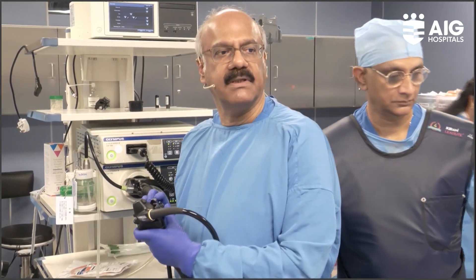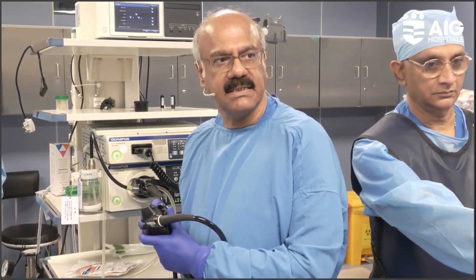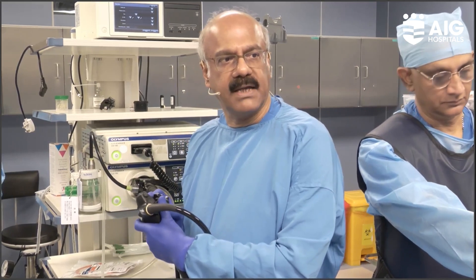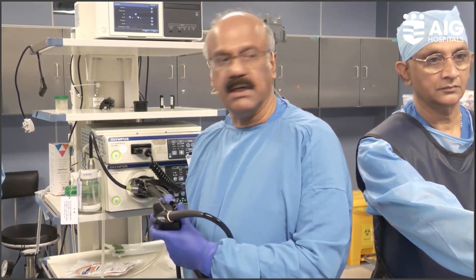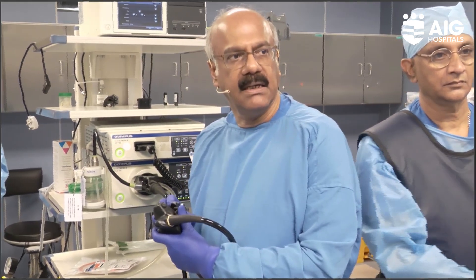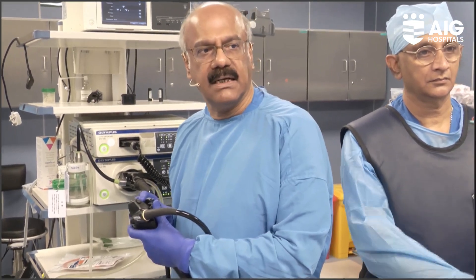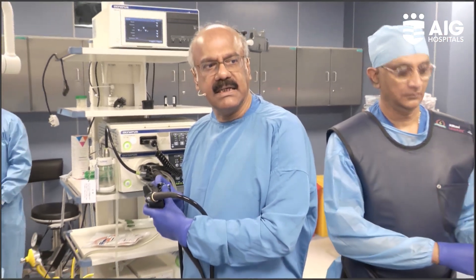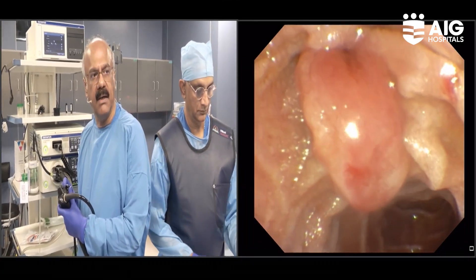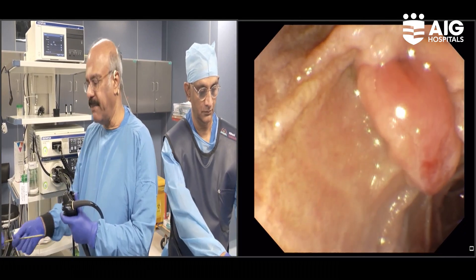This is a patient who has come with recurrent attacks of pancreatitis, and a previous endoscopic examination showed an abnormal bulky papilla. She has had some attempts at another center at a sphincterotomy, biopsies were taken, but they couldn't get any pathology.